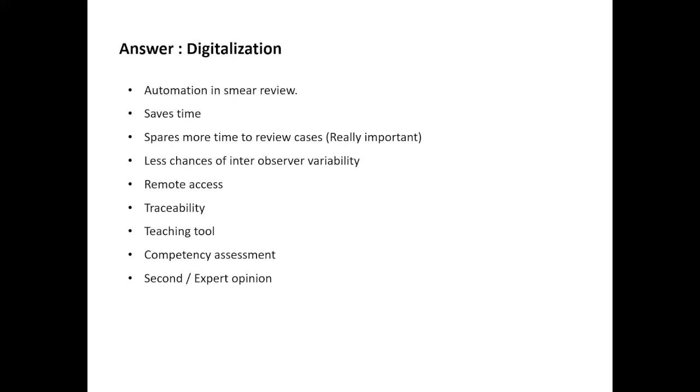You can use it as a teaching tool. In fact, I have started doing this. I put out a picture to all my postgraduate students, one cell or two cells or a field of view, and I asked them to classify the cells. It has come up in a big way in competency assessment. CAP sends us these digital pictures for competency assessment. And second, you can get an expert opinion from any hematopathologist sitting anywhere in the world.